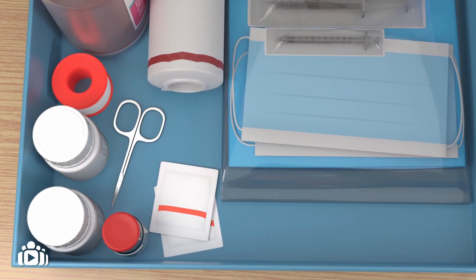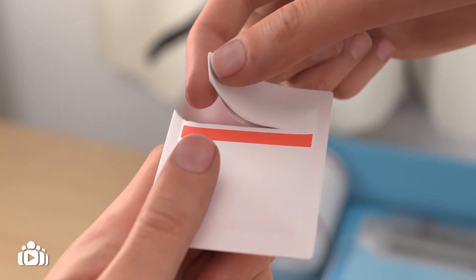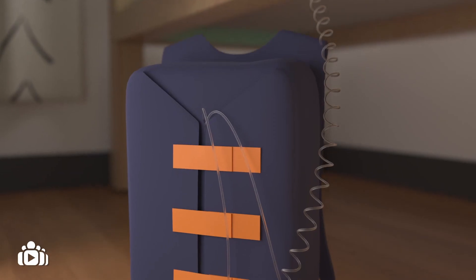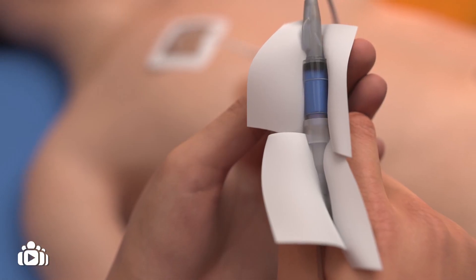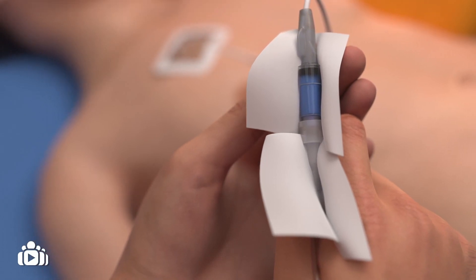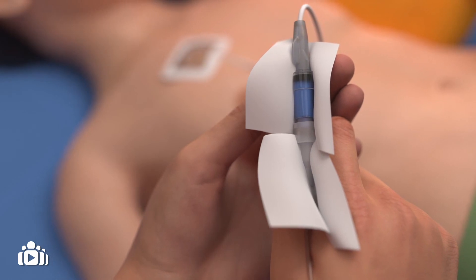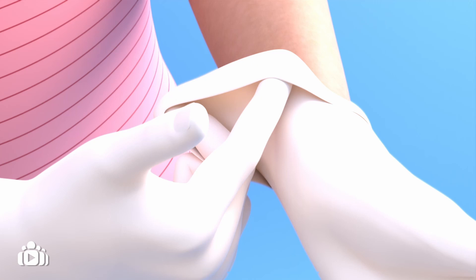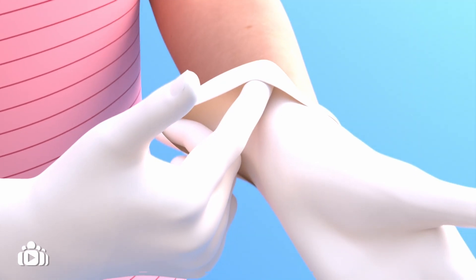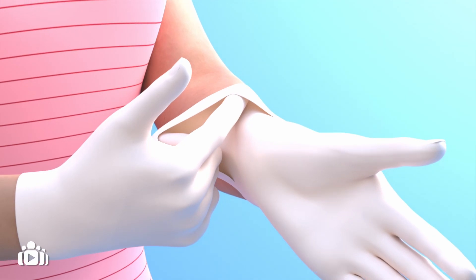Then, put antiseptic solution called alcoholic chlorhexidine on a sterile gauze. Ensure your child is positioned comfortably with his or her top off. The catheter hub is then disinfected using the gauze with antiseptic on it. Wipe the catheter hub with the gauze for 30 seconds. The person who is going to disconnect the catheter should then put on sterile gloves. Some clinical teams may also encourage you to wear a sterile gown.